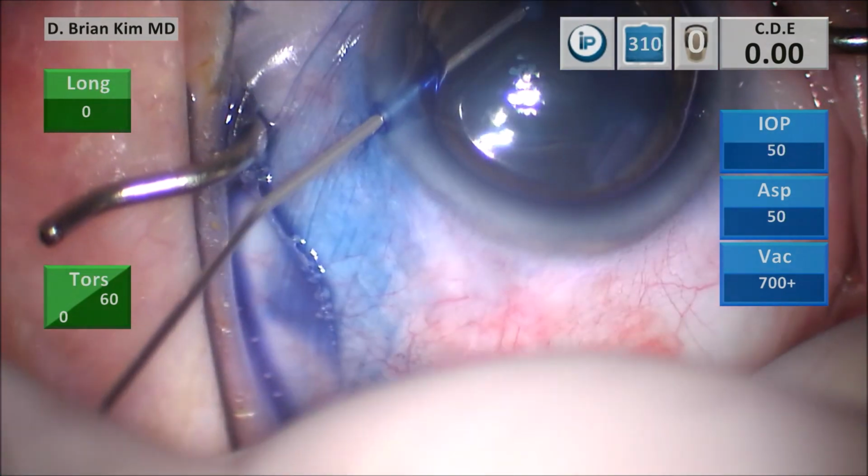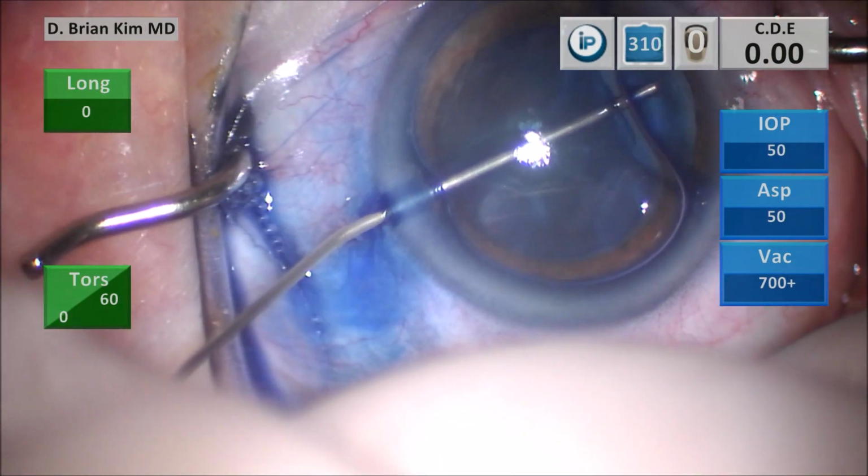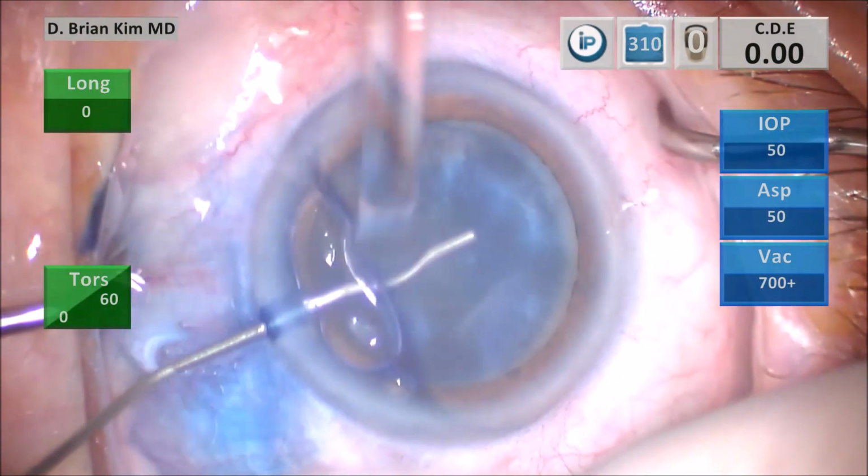And this is the dispersive viscoelastic. I'm starting from the other side and pushing out the bubble and the trypan blue.